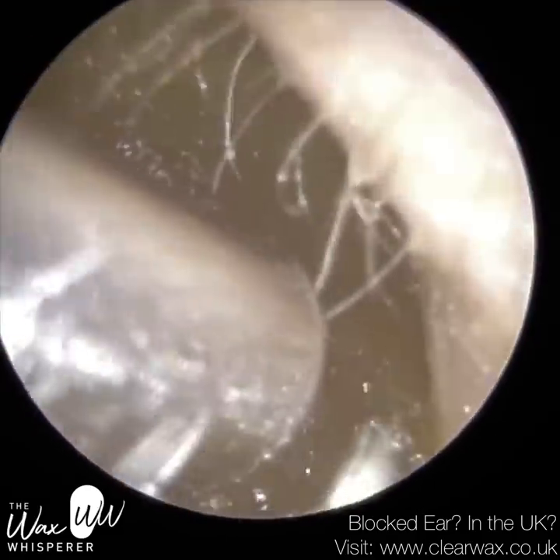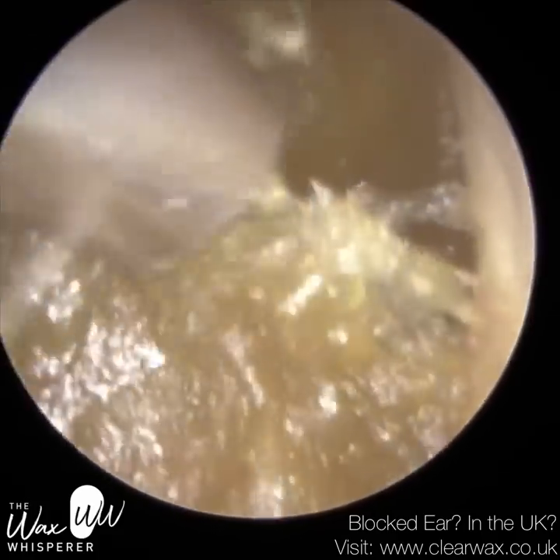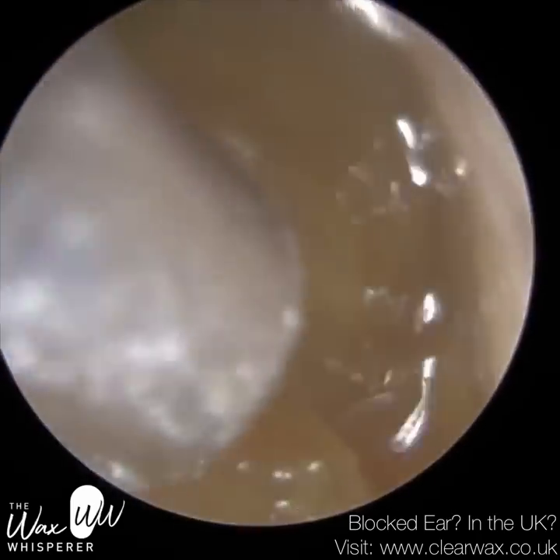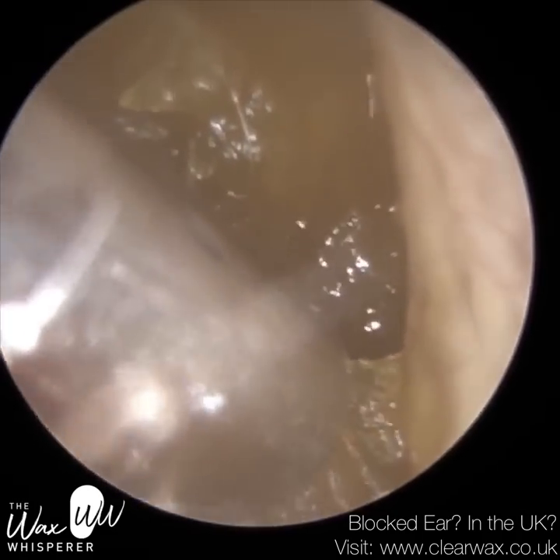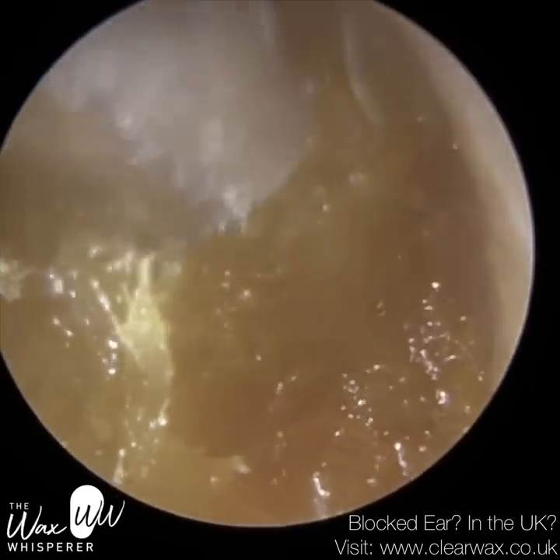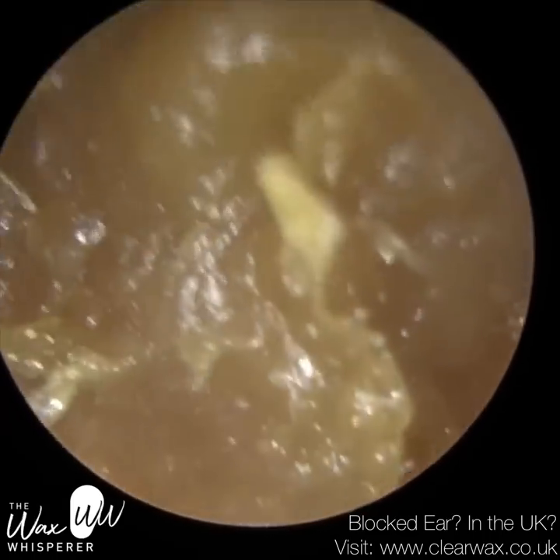We have here a patient who attended with a blocked ear. They were on holiday when this blockage occurred and it all happened after they went swimming and got water in the ear. The last time they attended was several years ago and it was a similar issue then — also whilst on holiday. The patient instantly realised as soon as they got into the water that it might spell trouble, because the patient is prone to a wax impaction.